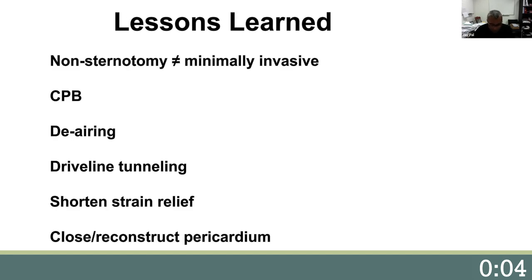There's certainly a learning curve to any new procedure, but most cardiac surgeons can rapidly include this technique into their skill set. A few pointers that I've picked up along the way include making the incisions larger than initially expected. This allows for greater visualization and allows the surgeon to become comfortable with the intracorporeal portion of the operation without being limited by small incisions. With practice, however, the incisions can be reduced to less than 10 centimeters with good results.